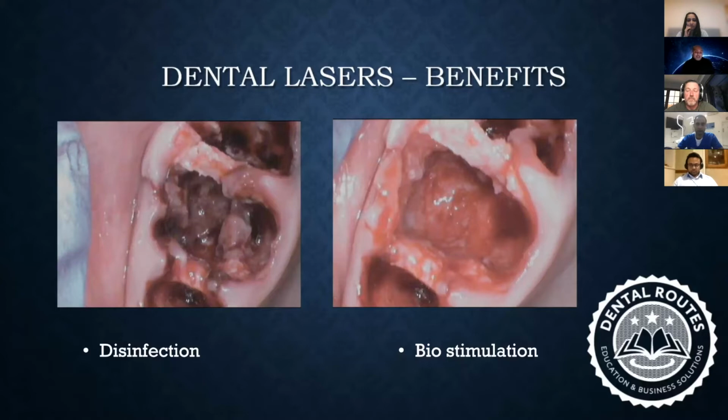But that is a thing of the past in my practice, because you see that site on the right. That is after I have used my erbium YAG laser to literally clean up the whole socket, and it looks so crisp.